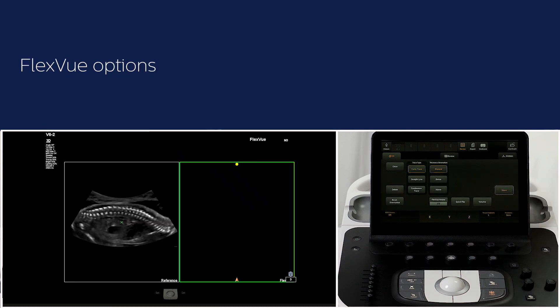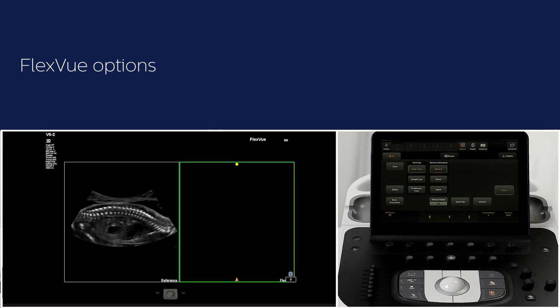The FlexView controls will appear on the touchscreen. Before launching the FlexView trace, you will select the trace type and the thickness orientation. The trace type will depend on how you want to draw the line through the anatomy. You have the option of curve trace, straight line, or continuous trace.